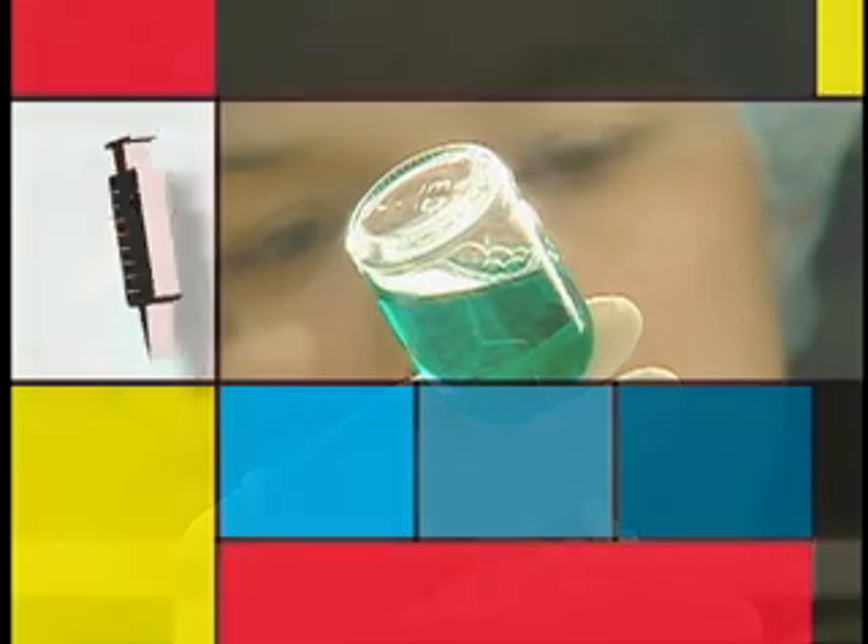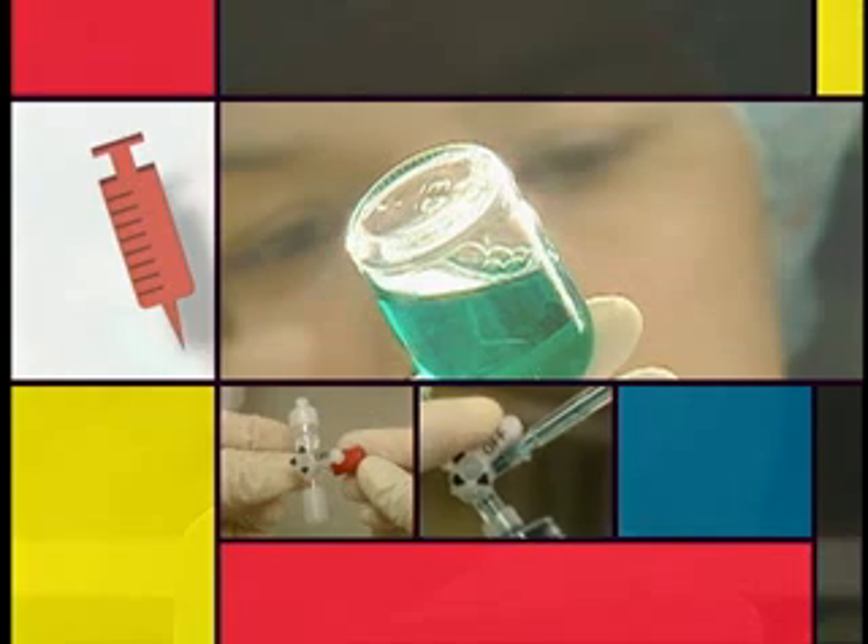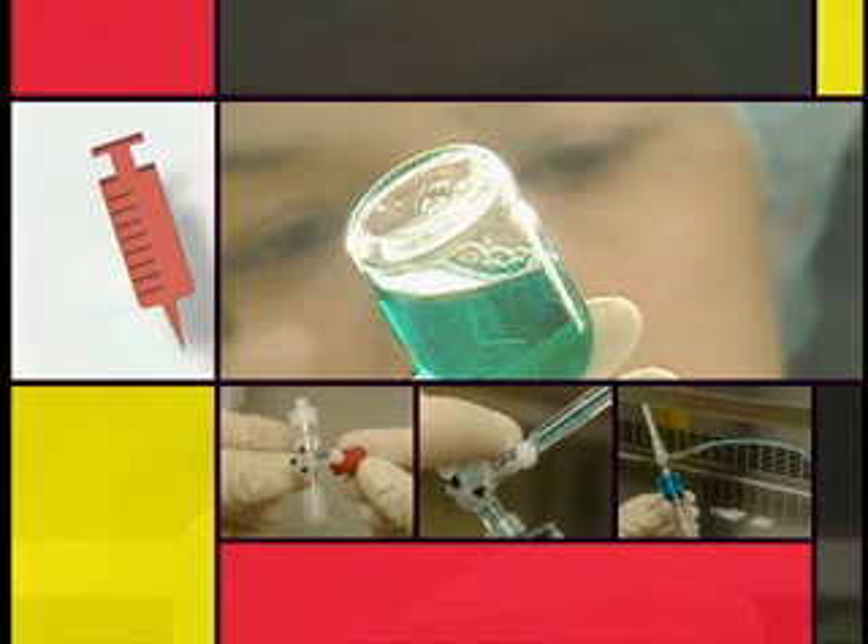A multiple additive set can be used to facilitate the reconstitution and withdrawal of solution from several vials of the same medication. We will look at how such a device is used next.